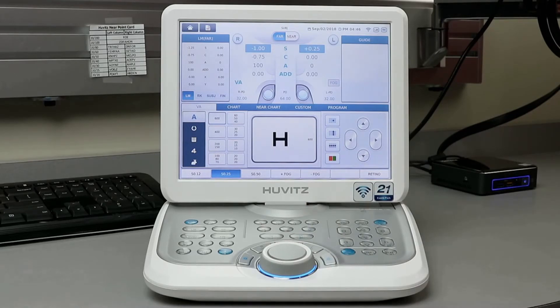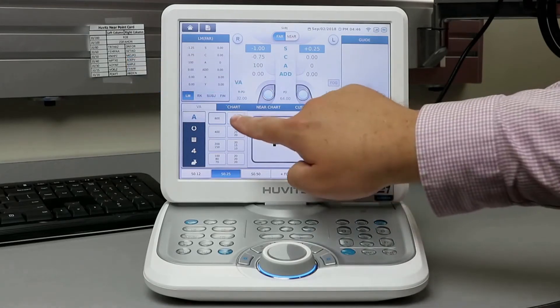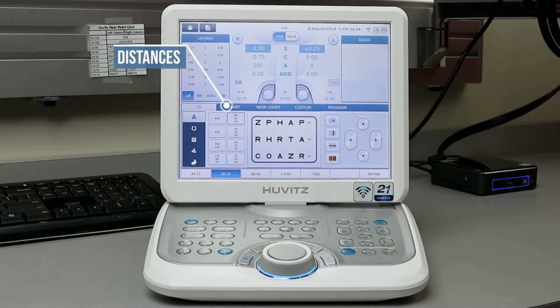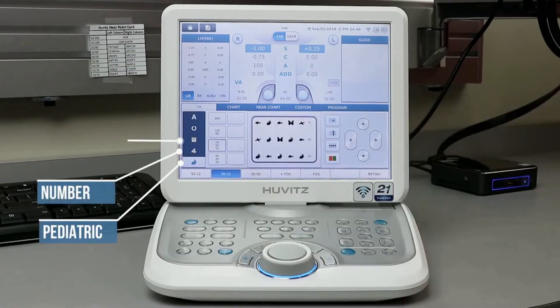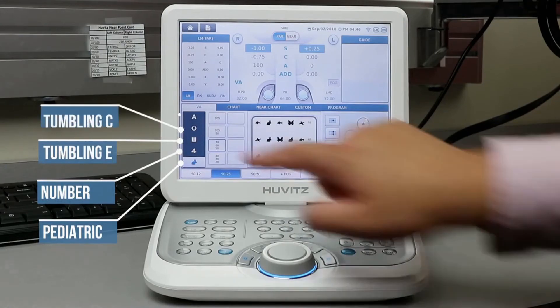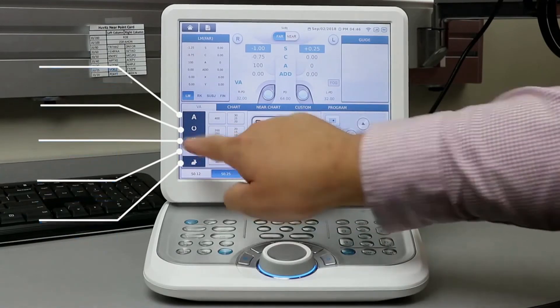In the center, you will see what is projected on your digital acuity chart. To the left-hand side, you will be able to use the buttons to change your distances as well as which chart you would like to project. On the far left, you will see pediatric, number, tumbling E, tumbling C, and letters.